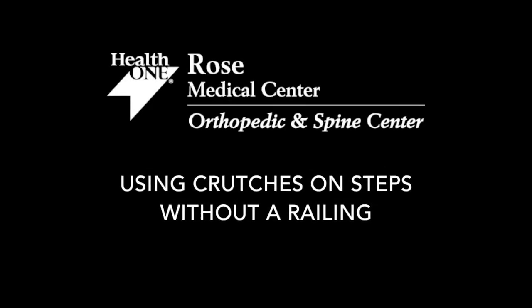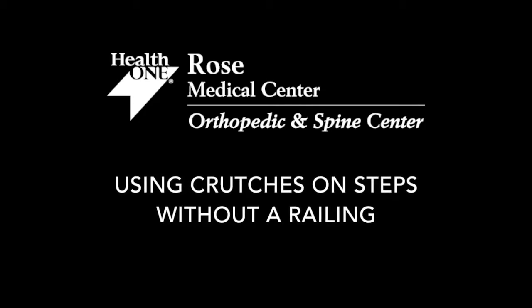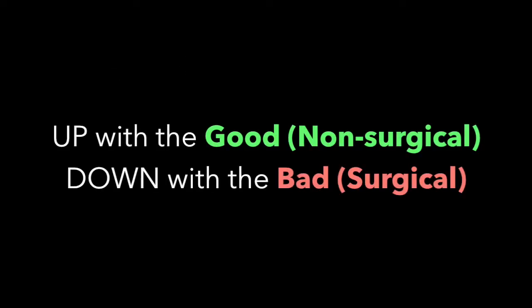Using crutches on steps without a railing. In this video you will see how to ascend and descend two steps using crutches. The general principle to remember when approaching two steps is to go up with the good and down with the bad.